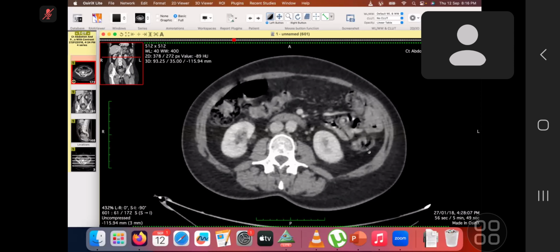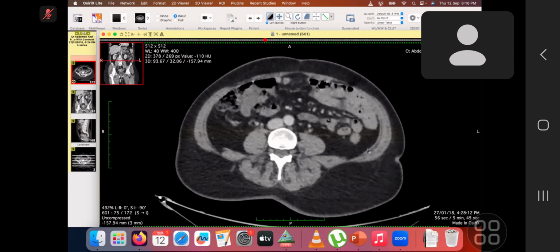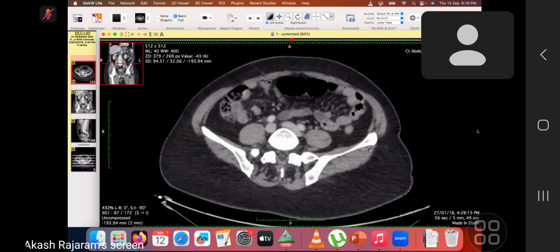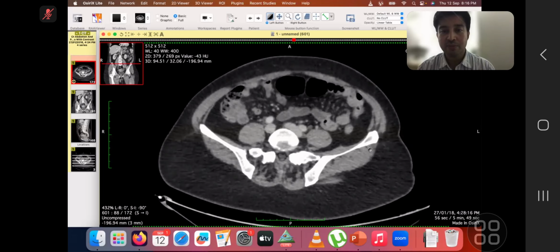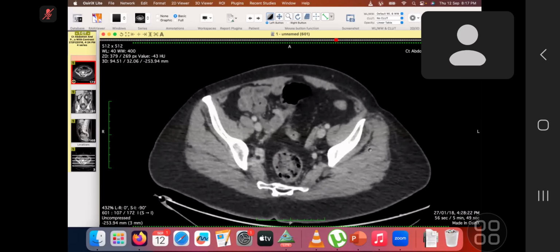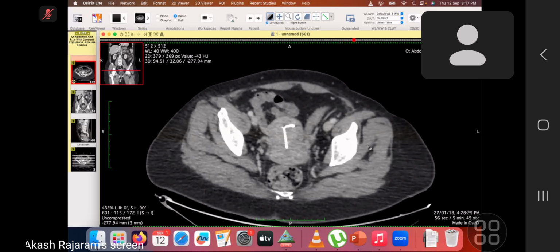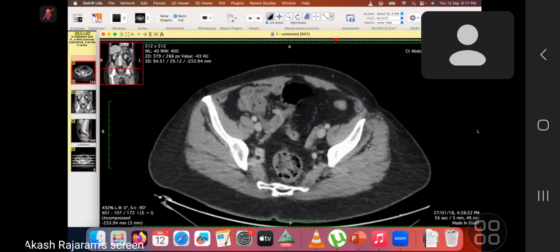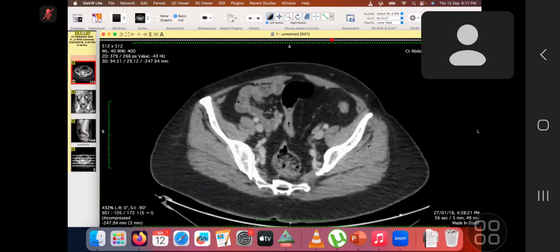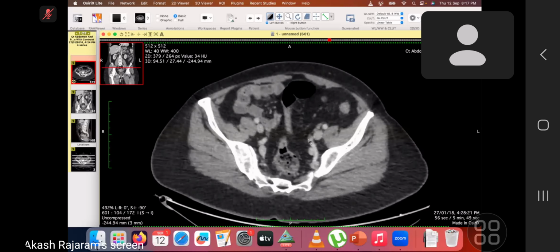Okay, I'm now searching at the site of patient complaint. In the left lower abdomen, she feels some discomfort and swelling. There's like a small spigelian hernia right there.